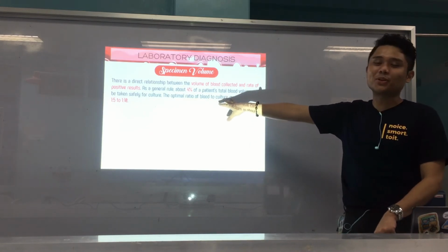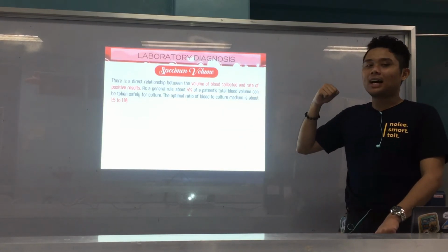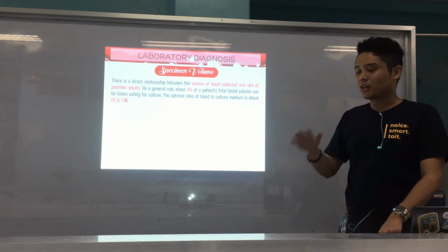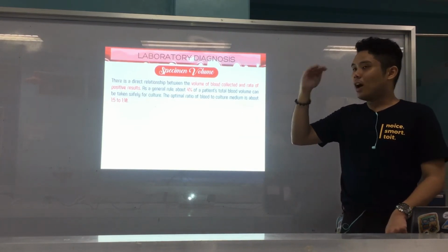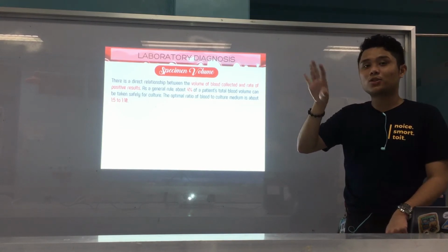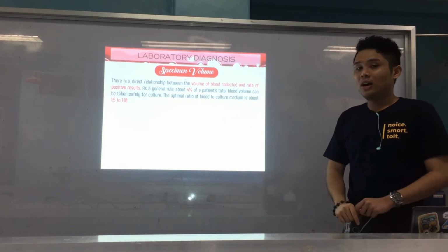So 4% of the total blood volume of the patient can be safely taken for culture. Again, the patient's blood won't run out. And our ratio is 1:5, blood to broth. So there is much more broth than blood. Okay? 1:5 to 1:10.